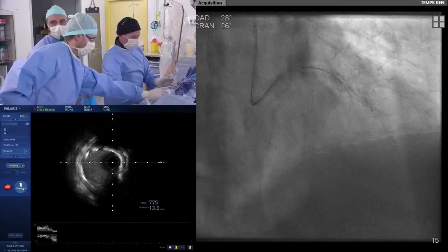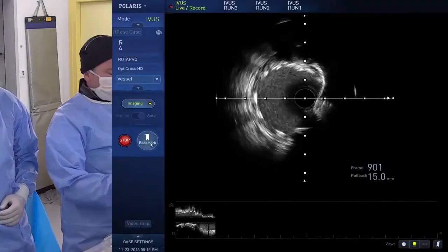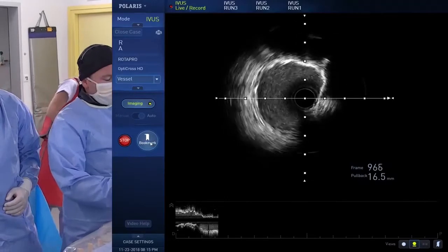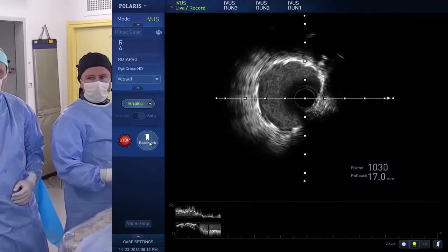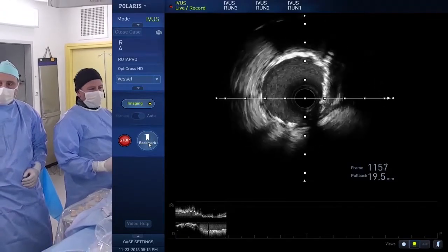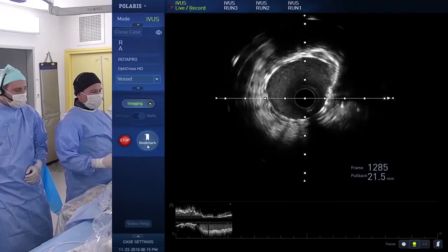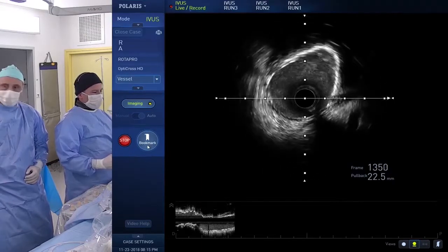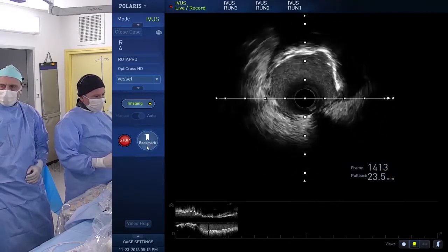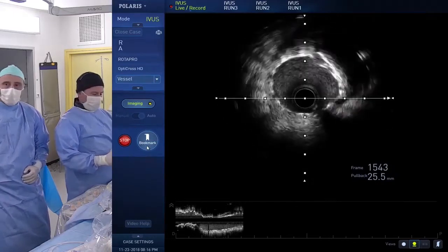We have published a short theory of stent ablation using rotablator. If you do this, you have to be sure that your stent is well apposed. Yeah, correct. And this is only a dog bone effect, and you have to manage only a malexpansion, but there is no malapposition, and thanks to that, you will only break the fibrosis and the under-expanded strut, not all the stent. Shall we have a look at this IVUS, Adam?